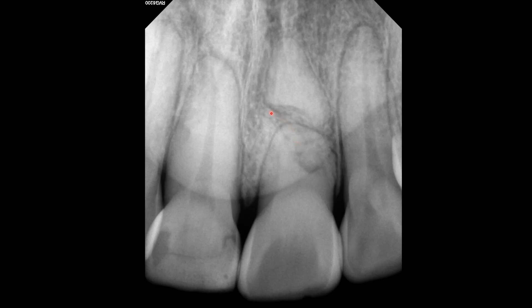We can see distinct separation of the root fragments. These fragments are not aligned. You can also see what appears to be the PDL space. There is also a roughly circular mixed density area. Can this be internal or external root resorption? I also do not see the pulp canal.